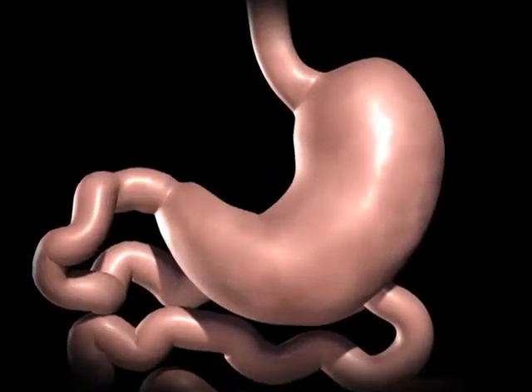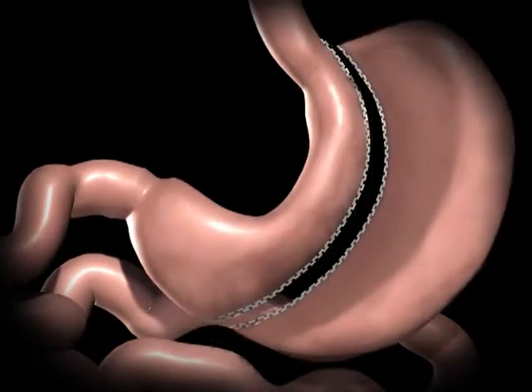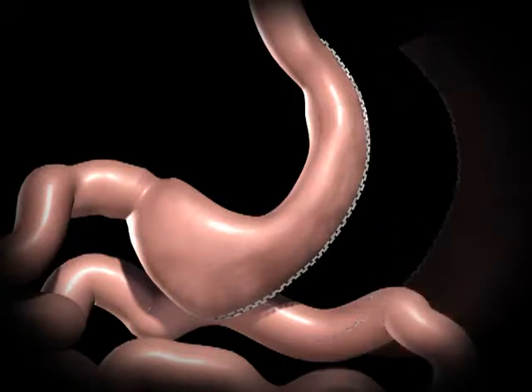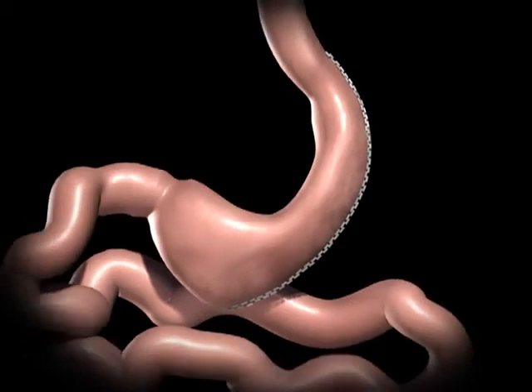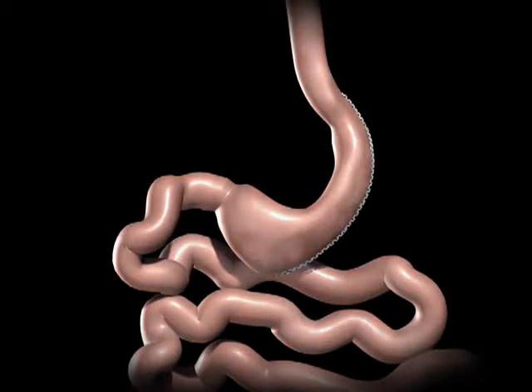During a sleeve gastrectomy, a thin vertical sleeve is created by using a stapling device. This sleeve will typically hold between 50 to 150 milliliters, or is about the size of a banana. The excised portion of the stomach is removed. The newly created gastric sleeve is able to hold approximately one-tenth of what the stomach was able to hold before.